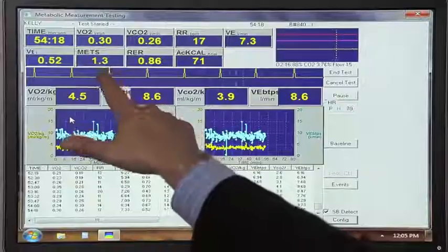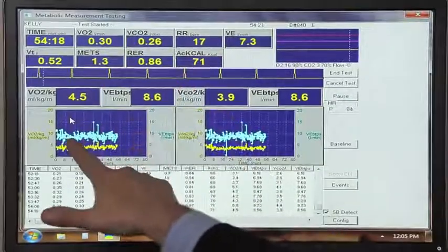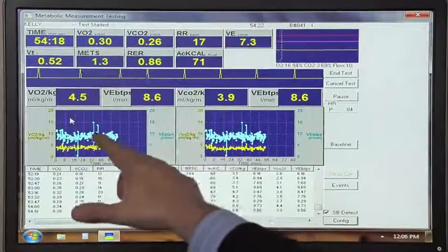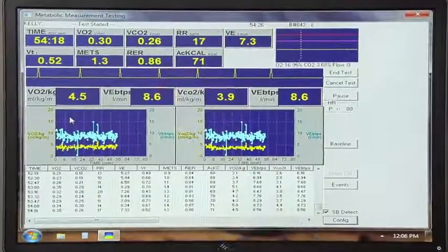In a few minutes, we're going to have Stephanie get up and do some stepping exercise. I'd really like for you to keep your eye on the screen and watch how these variables change over time. As she steps up and down, she's going to need more energy, so she's obviously going to need to take in more oxygen, and as a byproduct she's going to produce more carbon dioxide — which is why exercise is important for caloric expenditure and is a big part of health, particularly in metabolic disease.